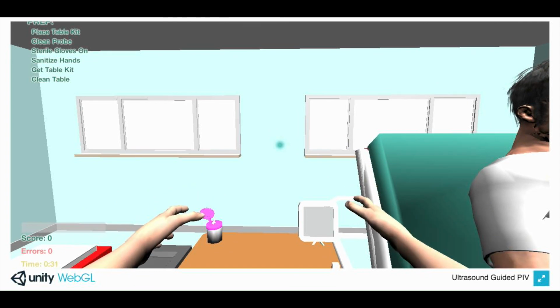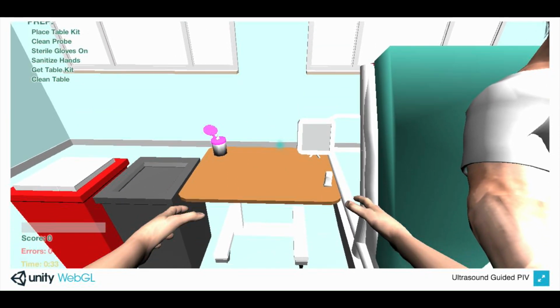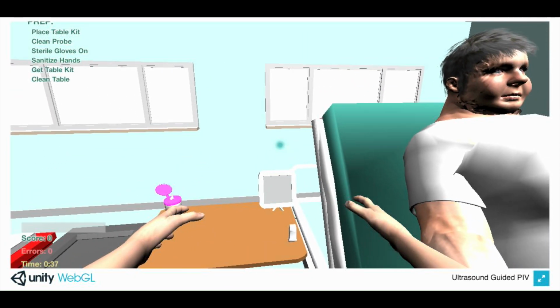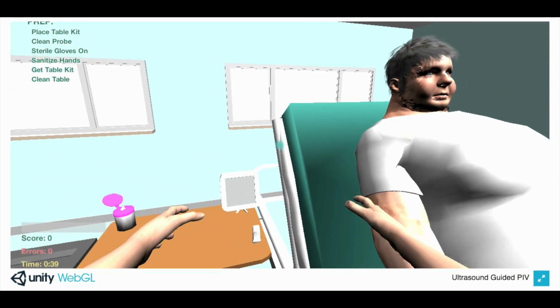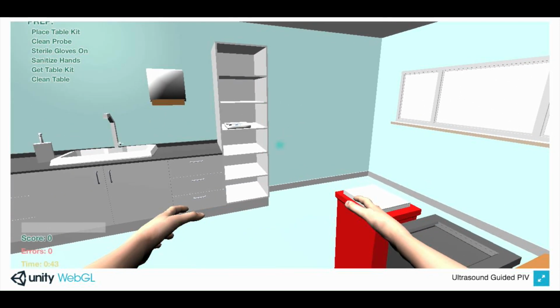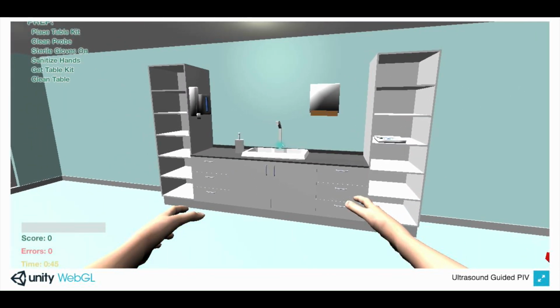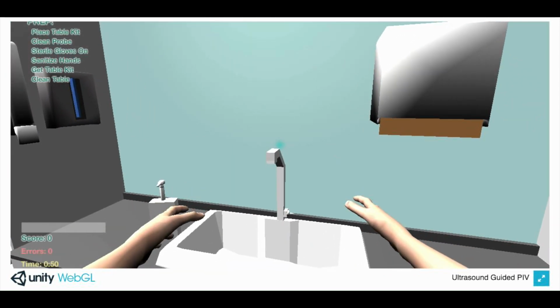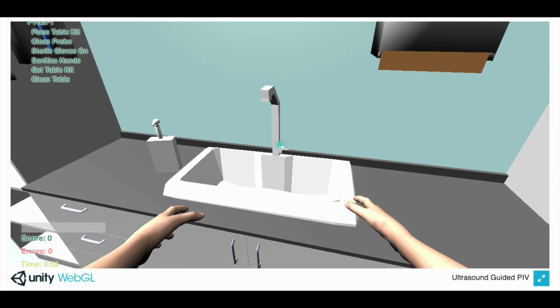Or, for you lefties out there, use the W, A, S, D keys, with W being up, A moving you left, etc. For example, let's say you look to the left and see a sink and you want to wash your hands. Use the arrow key or letter keys to get you to the sink. Please note, you have to get pretty close to an object before you can use it.